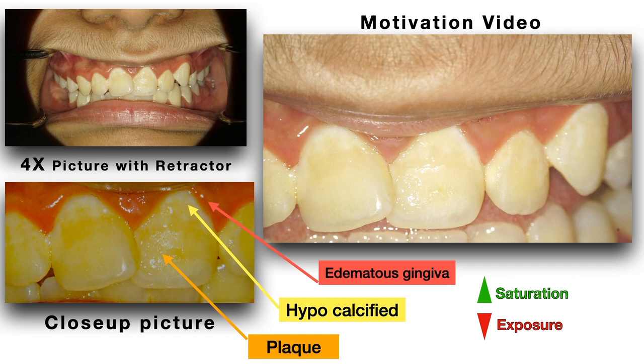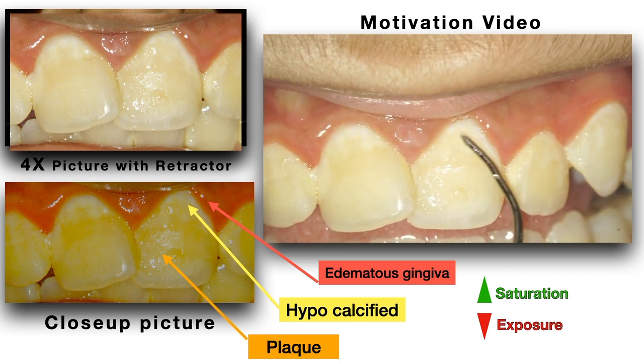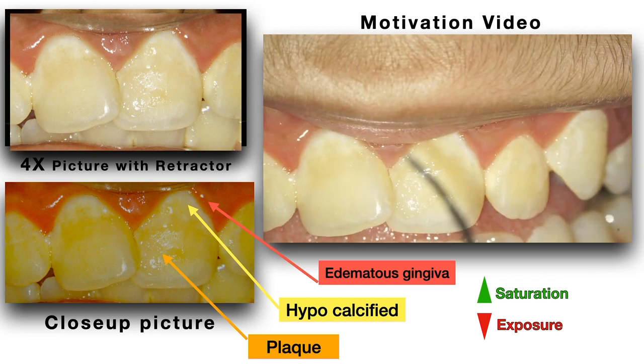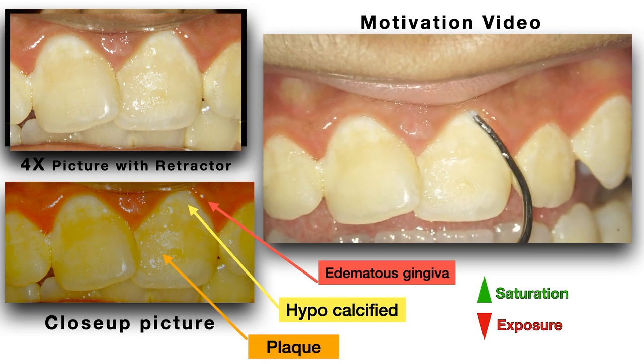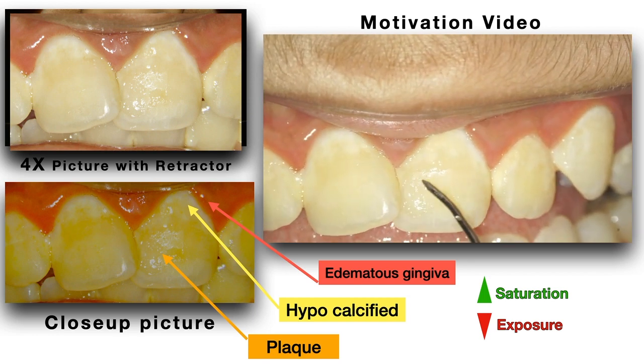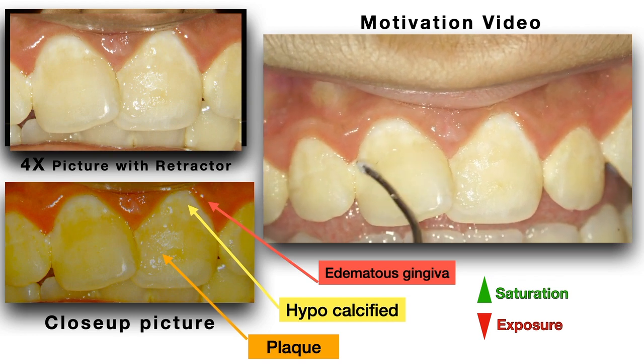This is possible with a dental professional camera, but with the microscope it is very, very easy because I can take a close-up picture for the patients with the dental operating microscope. Directly they can see what happens in their mouth. Also we can take a short clip. If he says that he does brushing in a correct way, I show him the plaque, and if you are able to do good brushing, why are you leaving this amount of plaque on your anterior teeth, despite the posterior ones that retained more plaque?